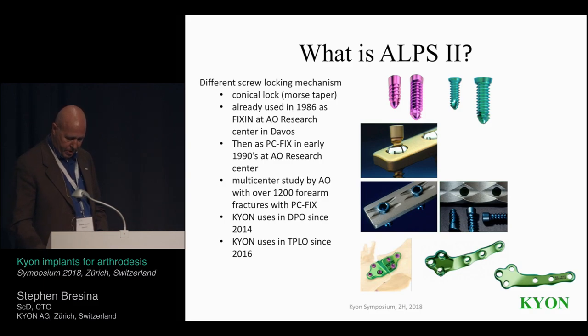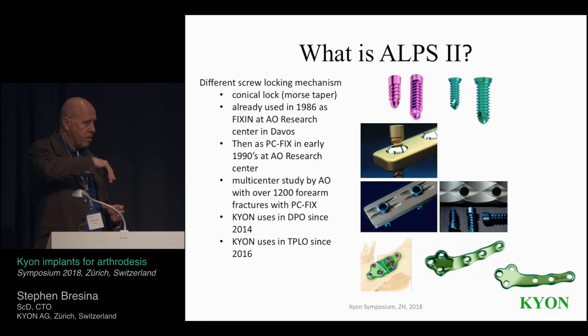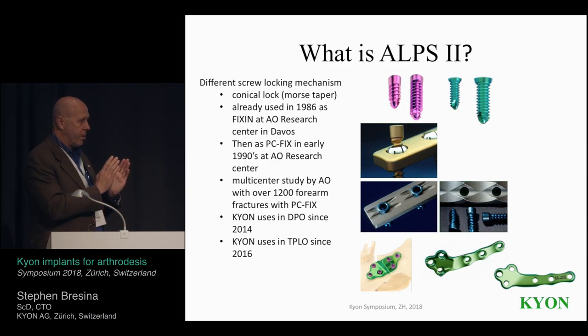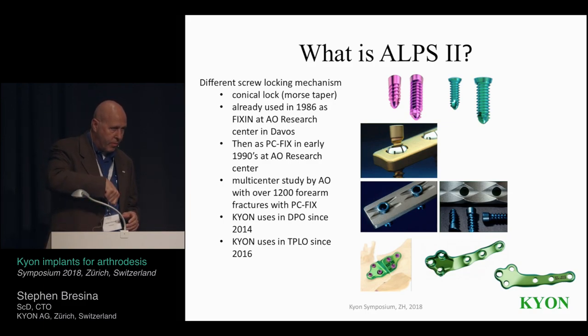In the current ALPS system, the hole in the plate has a single row of a thread in the bottom of the hole. So when you use an ALPS plate now, you have to go backwards a little bit with the screw to feel that you start to engage that thread correctly as you drive the screw down into the hole. The tension that is now needed to seat the cone is developed from the screw to the plate. So as you turn it tight, you don't need to put any axial force on the screw, because the first thread there is going to pull the screw down into the plate and lock it. With just a conical head, with a conical hole in the plate, you have to develop some axial force. So you need the bone to either pull the screw down into the plate, or you have to put a little axial force on it yourself as you get to the end of locking the screw into the plate.